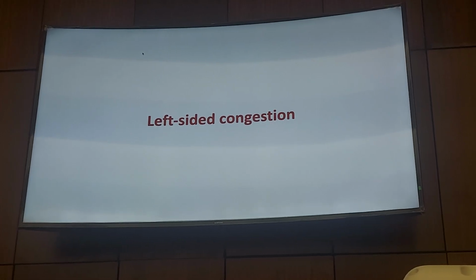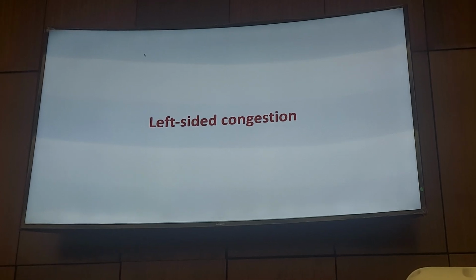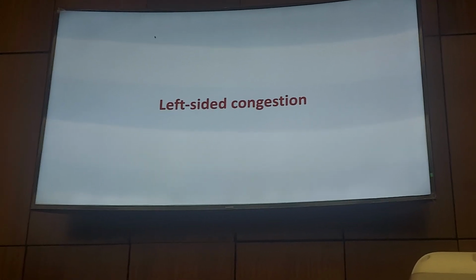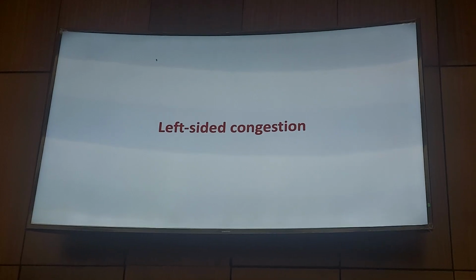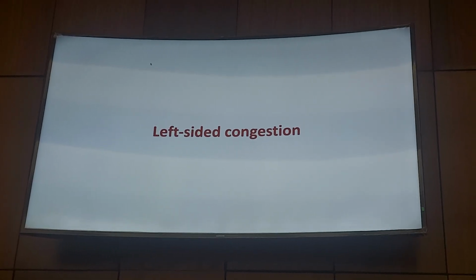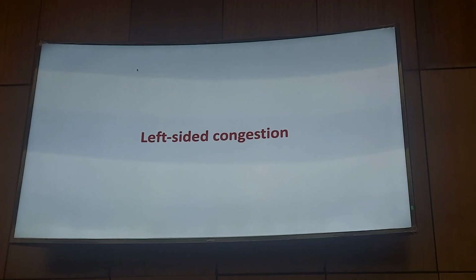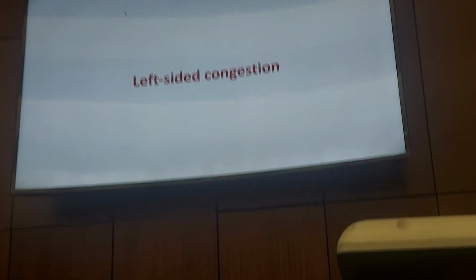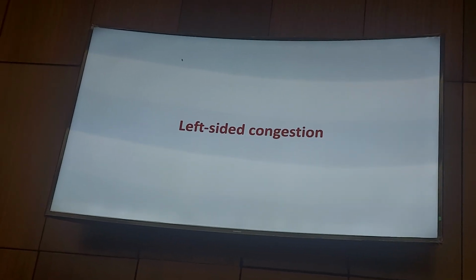I have a question for you. Yes. Thank you for your presentation, actually. I have two questions, one theoretical and one practical. The theoretical question: the big pitfall of IVC assessment, which is the gateway as you said, is that it is mainly affected by intra-abdominal pressure. And when we reproduce the VeXUS score, we go deep inside the abdomen, choosing the portal vein, the renal vein, and the hepatic veins, which will usually be affected also by the same pitfalls of the IVC regarding intra-abdominal pressure.